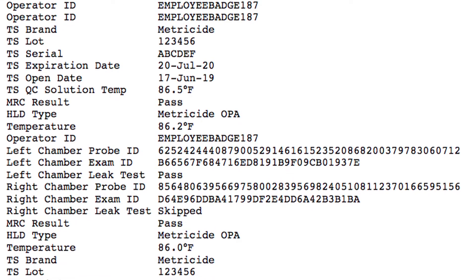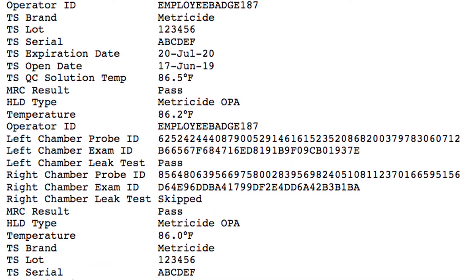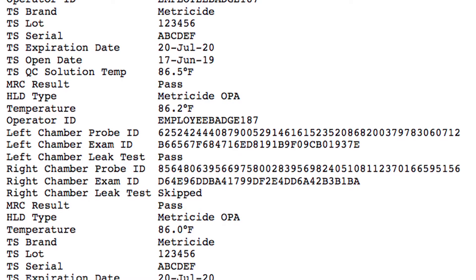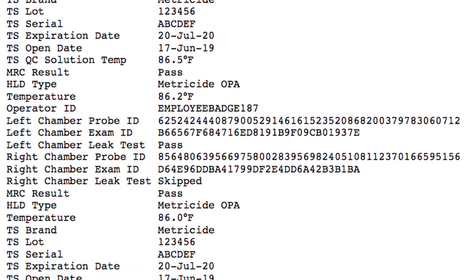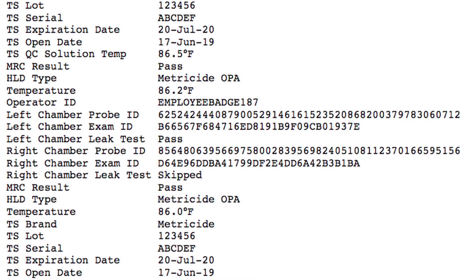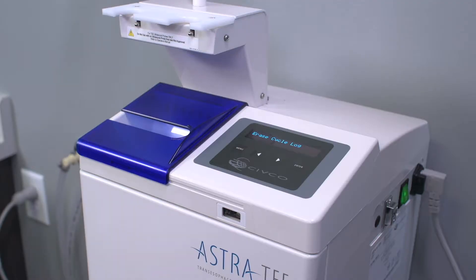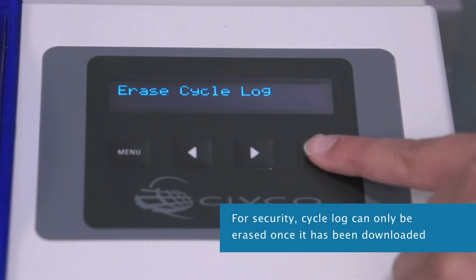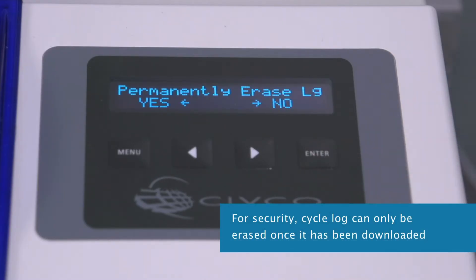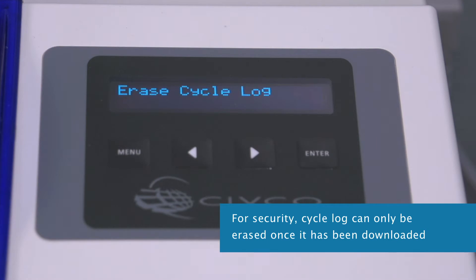If used: MRC test result, electrical leak test result, HLD type and temperature, and the cycle outcome. You can also erase the memory by scrolling through the menu and selecting 'erase cycle log.'